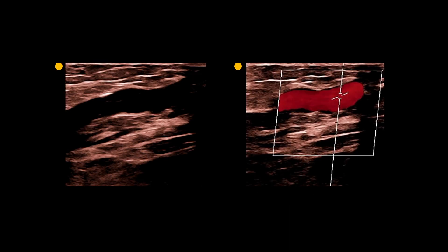If the graft is autologous, or taken from the patient's body, from a reverse saphenous vein, there is nothing remarkable about the appearance of the walls. In this case, it is best identified by its pulsating color and location down the length of the medial thigh. In some rare instances, they can go down the outer thigh to get to the anterior tibial artery.